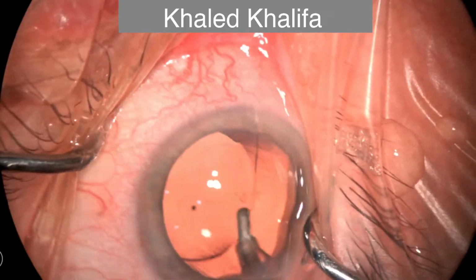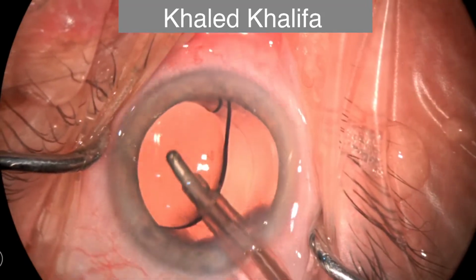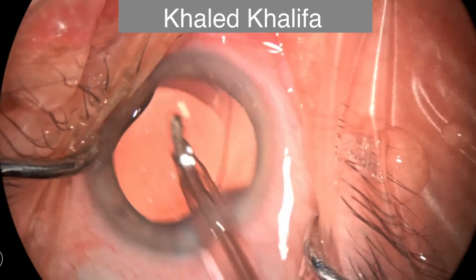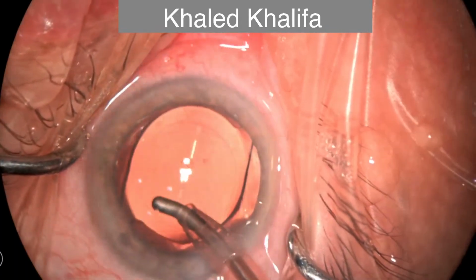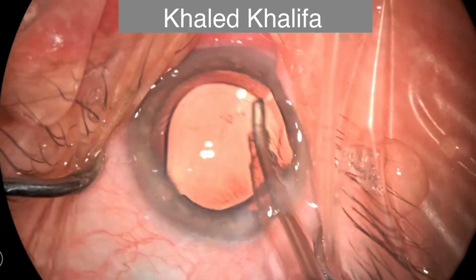I like usually to wash behind the IOL for fast improvement of the vision and give a short time for the IOL to take its final effective lens position.